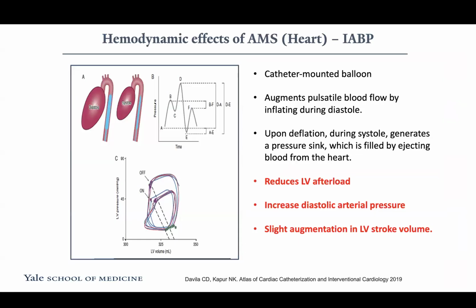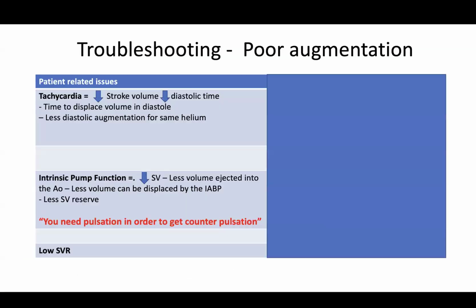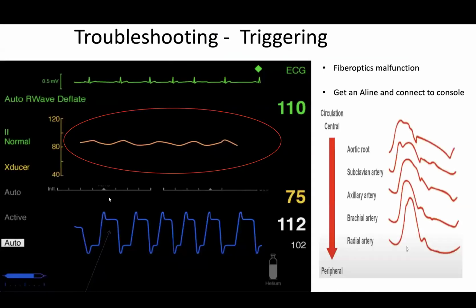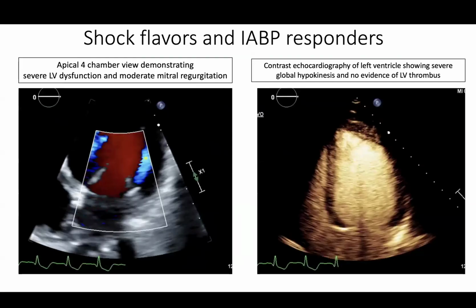So any questions about balloon pumps right now? How do they work? How to interpret the waveforms? How to deal with alarms? Right? They've been great. They've been around for a while. They still have some role in our cath labs and our ICUs, but maybe we can jump ahead and go down to. So these are all balloon pump waveforms and indications, contraindications, and all that.